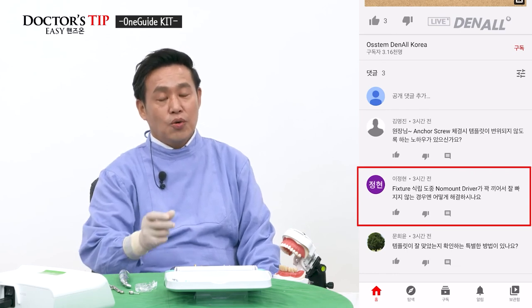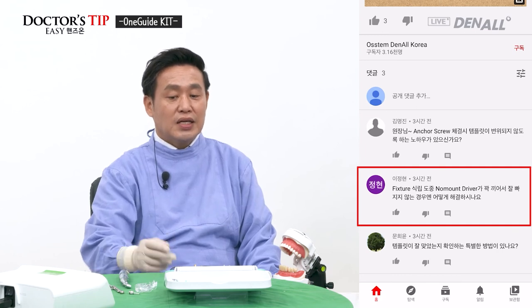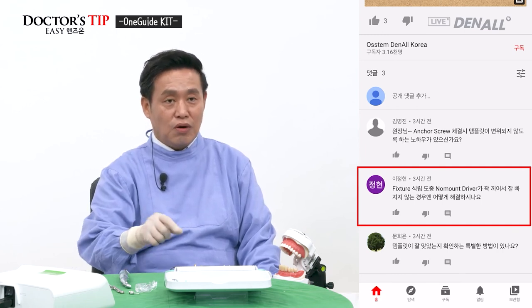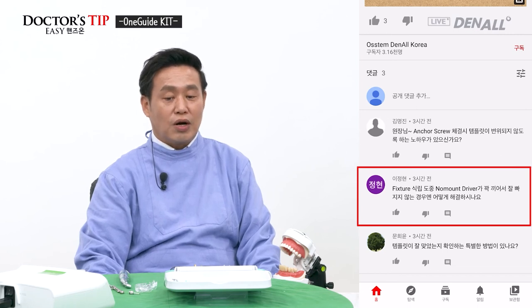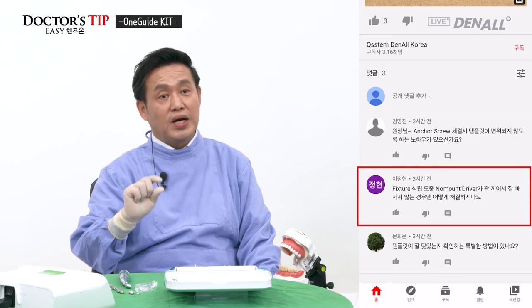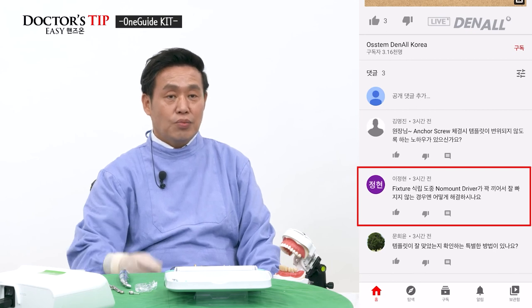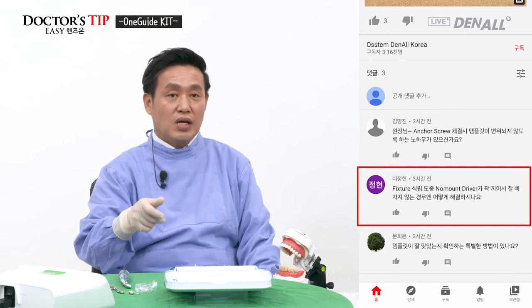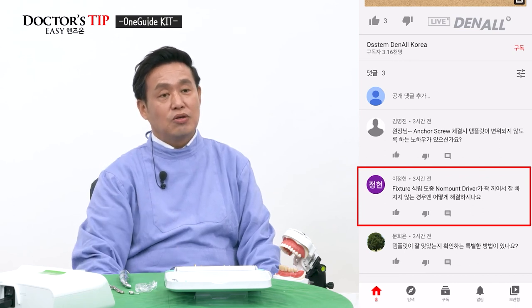So once the implant fixture is slightly loose, use fixture driver to get the final position. In that way, you'll be able to avoid major issues. With the no mount fixture driver, the barrel height is lower, so there's less jamming. So there's less problem. If there is jamming, if necessary, do reverse and loosen the fixture slightly, then it will be able to solve your problems.